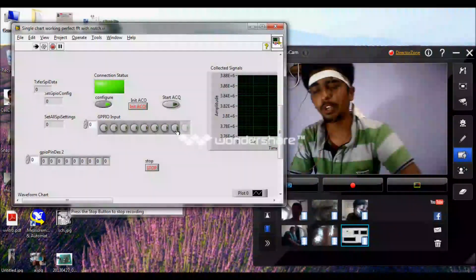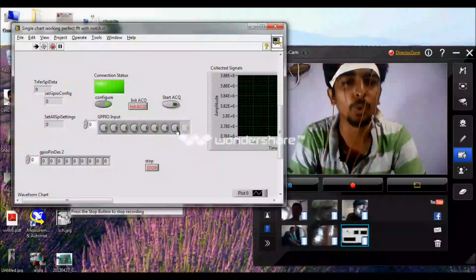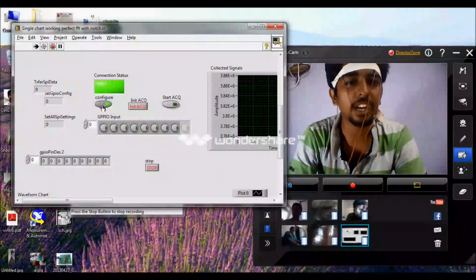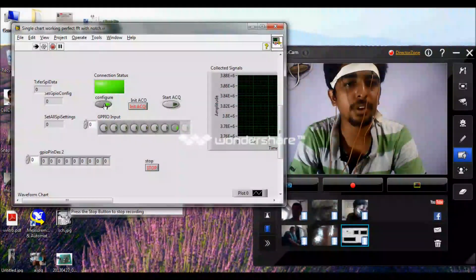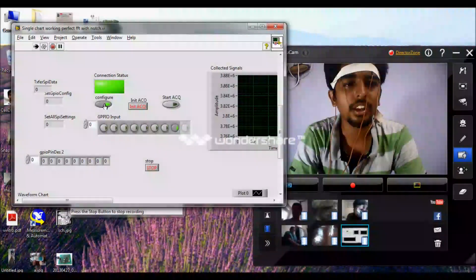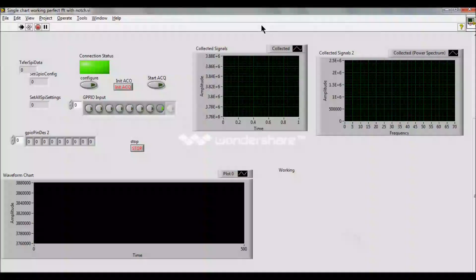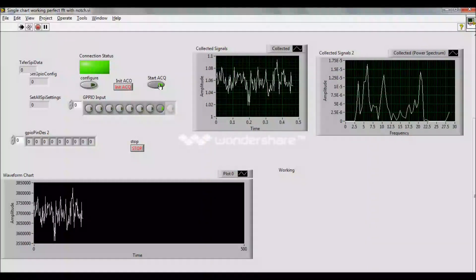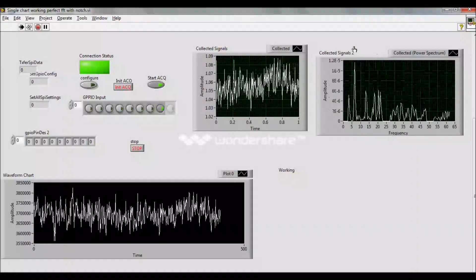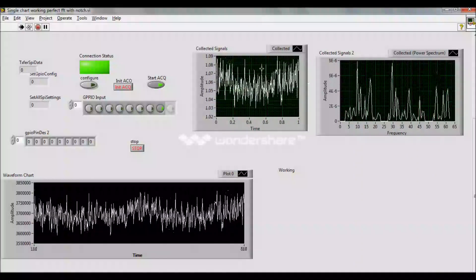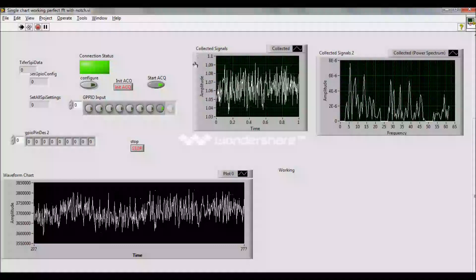I am controlling it with LabVIEW. The controlling and configuration process is over. Now we can go for acquisition. The configuration is over. Everything is okay. Now we can go for acquisition — I have initialized the ADC. I have started the acquisition. My device is transmitting the data. You can see this is the FFT of my received data, and this is a pure EEG signal from my brain.